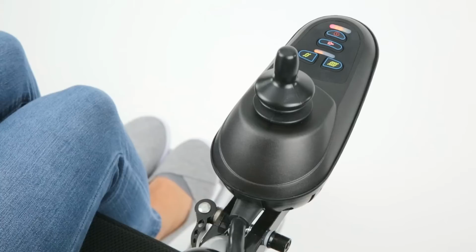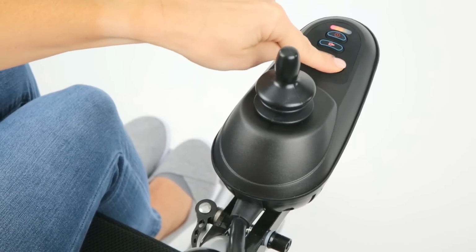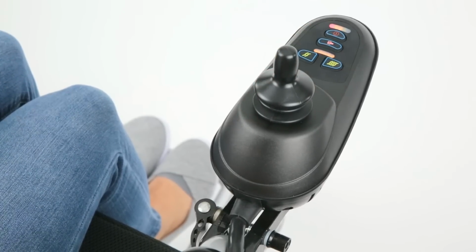The speed level will always default to the last speed adjusted on the controller. To increase or decrease the speed level, use the buttons on the bottom of the controller.